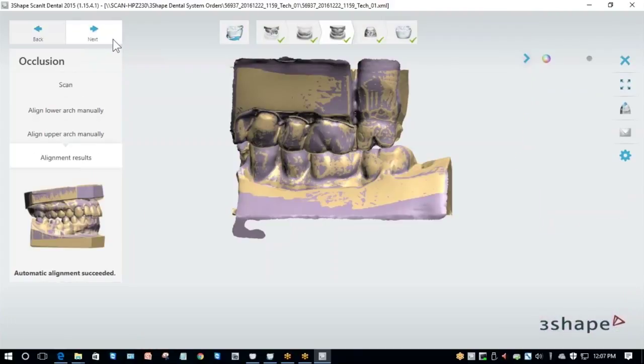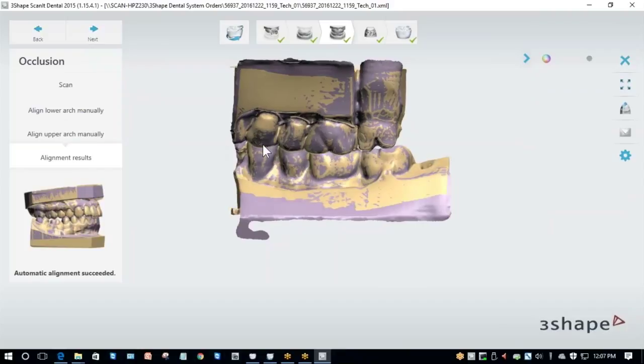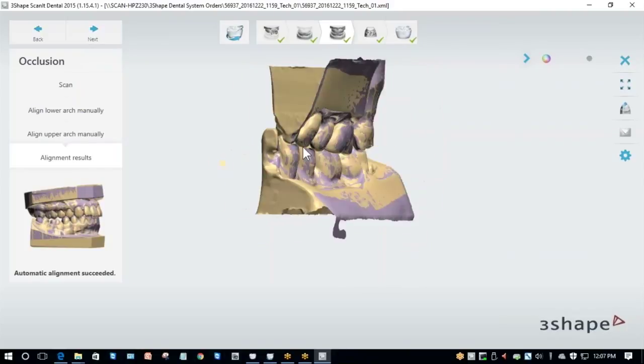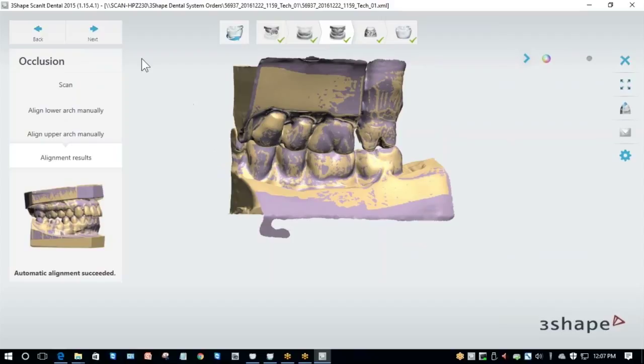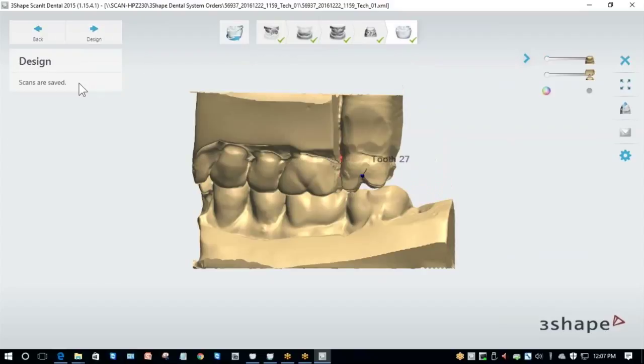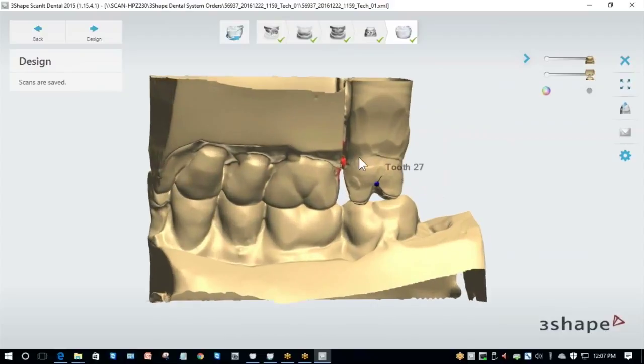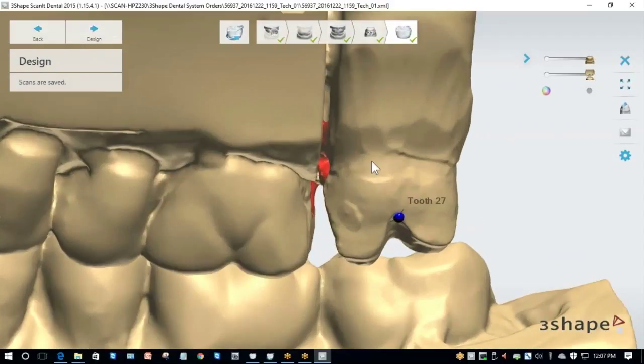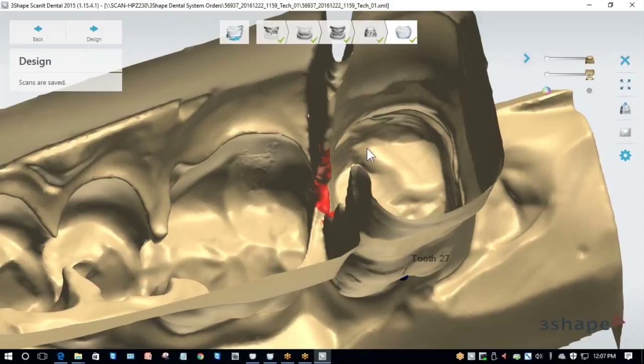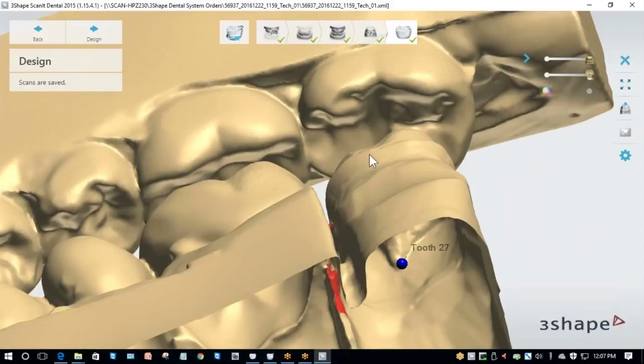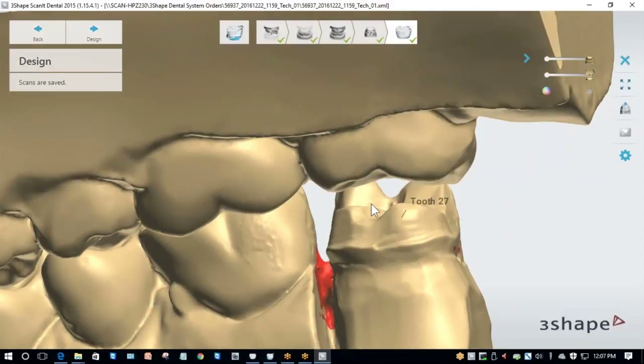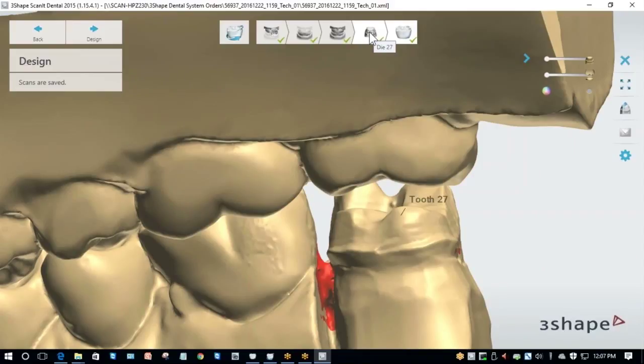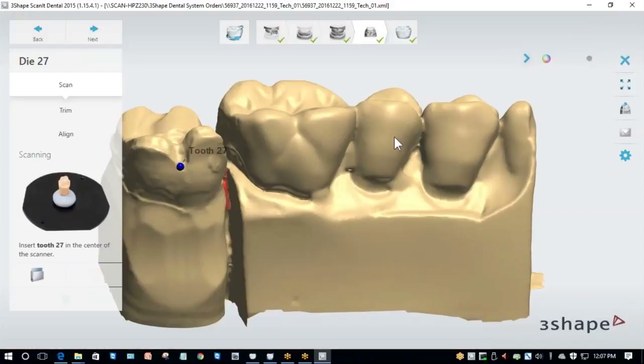Now that I've done that, I'm going to click Next and it will show me my alignment results with everything together. Everything looks good. I'm going to click Next again and now it went straight to the final step. This is because it thinks the die scan I did earlier is the die scan I want. If your scanner does this, it's okay. All we need to do is come over here, click on 27 or the tooth that we're working on, and then load up just that die.